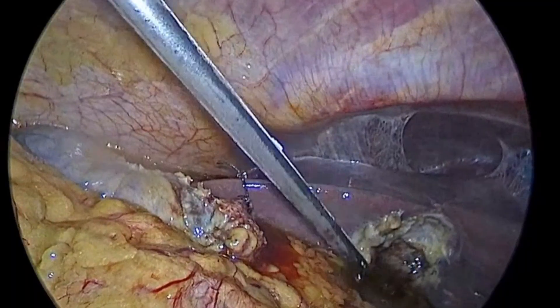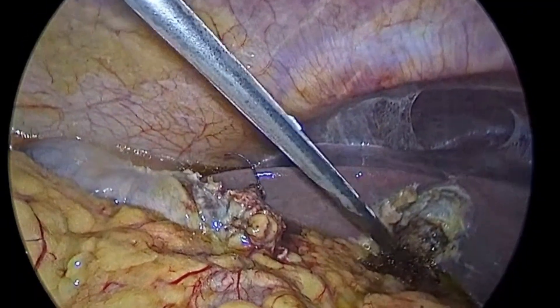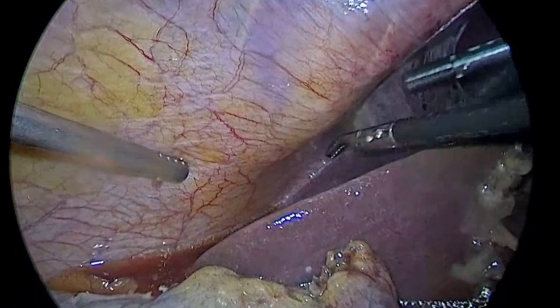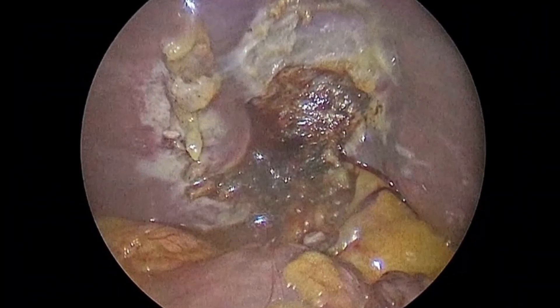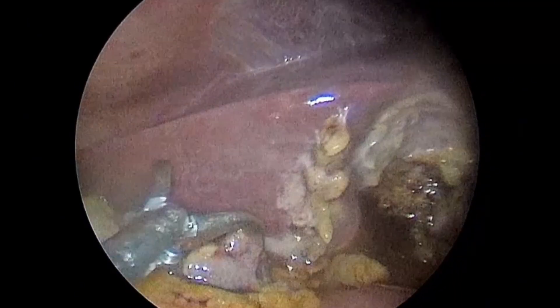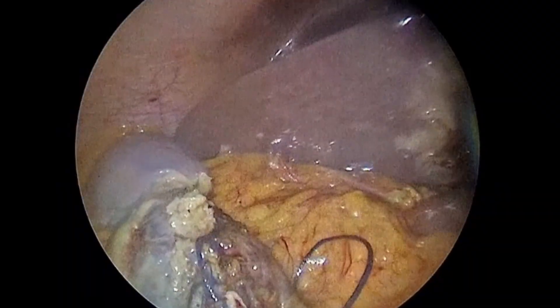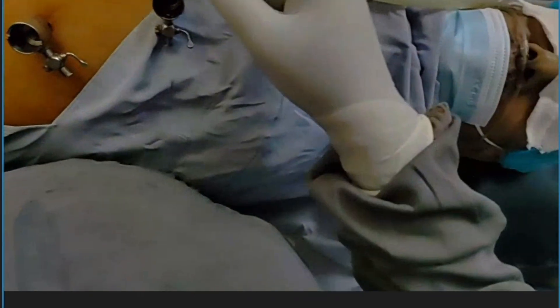Leave some carbon footprint — nowadays it is a hot topic to avoid carbon footprint. No active bleeding. As the patient is under spinal anesthesia we will need less analgesics; we keep pressure only at 12, and there is less stressing of the abdominal muscles as well as the diaphragm, so there will be less postoperative discomfort and pain. The patient will go home — it is now 2:45, he will start liquid diet at around 5:30 and go home at 8 p.m. — a day case.